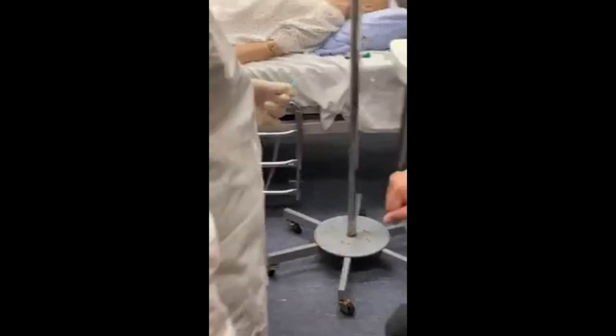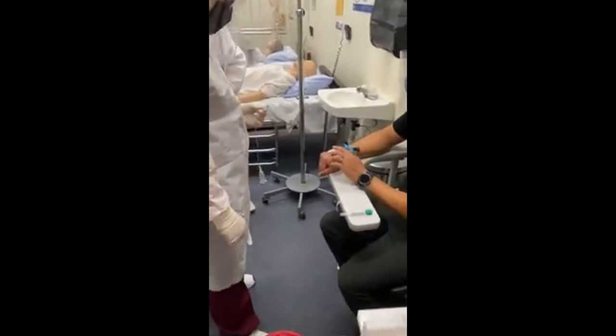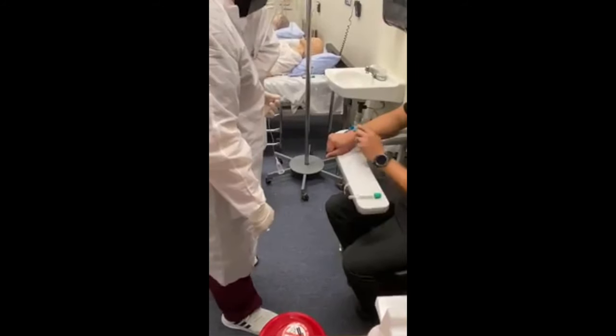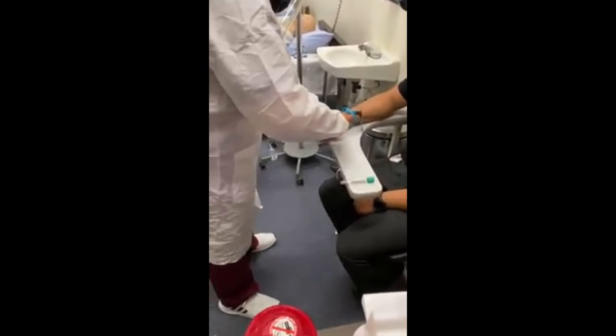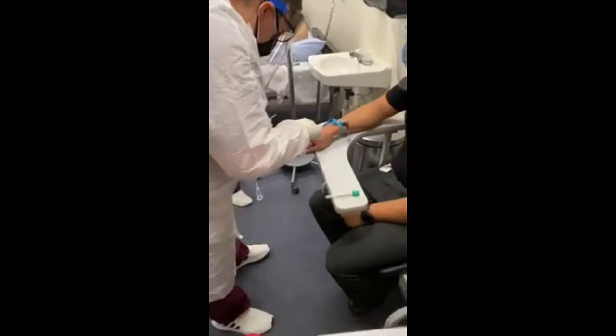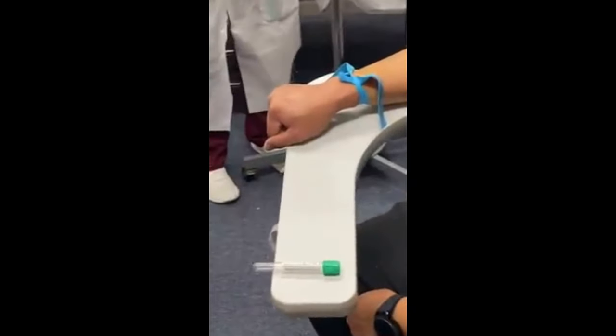And also, let's say for the vein, after you clean it and put on the tourniquet, you don't know where it's at, you can touch below or above just to verify. Right, yeah. So you can touch here. Yeah. Okay. So what I'm going to do is I'm going to stick it right there.